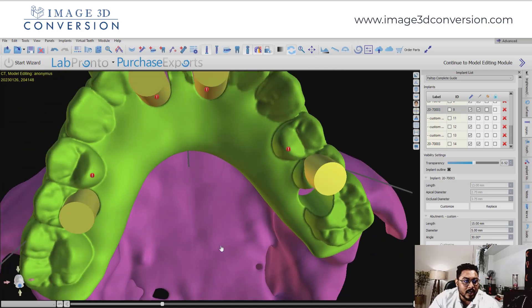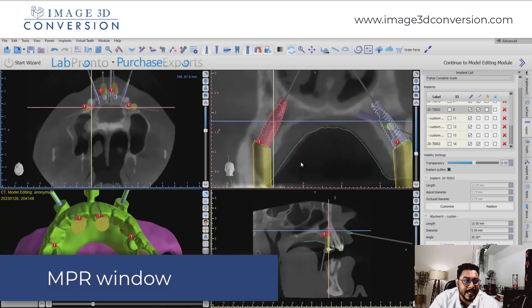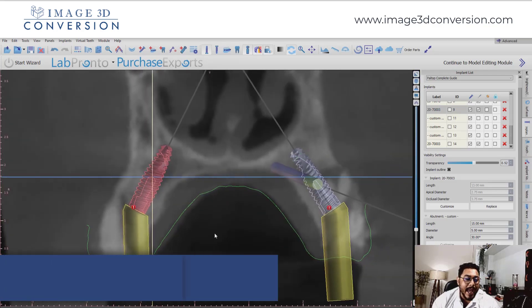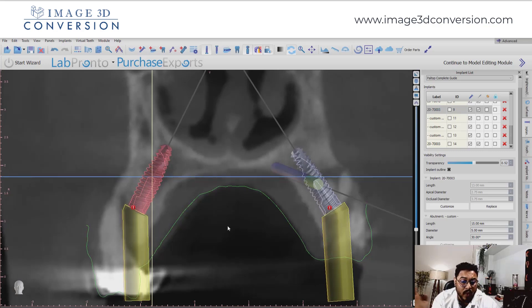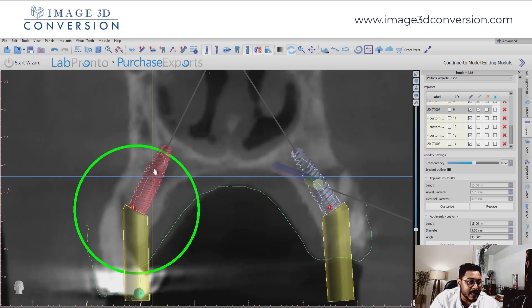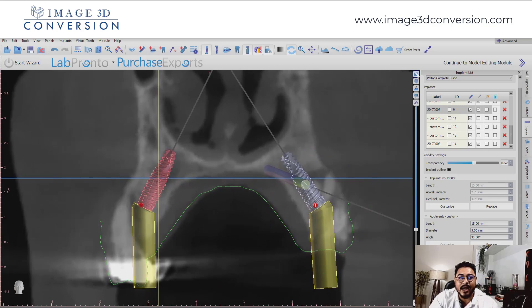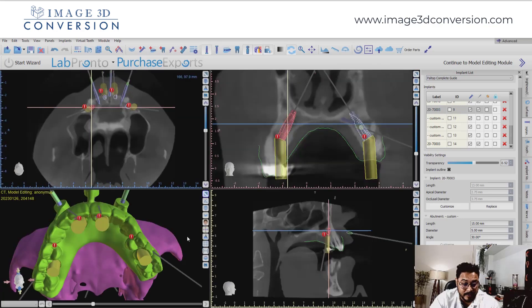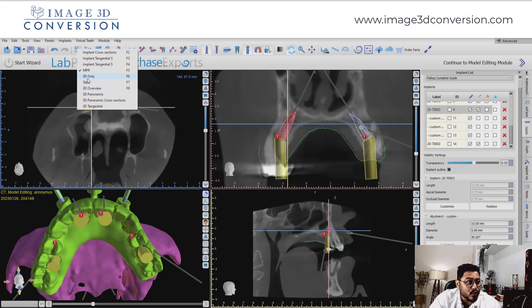One more window is the coronal window. In the coronal window, for full-arch cases, we position implants from one quadrant to another. For example, placing one implant in the first quadrant and then a second implant parallel to the opposite quadrant — simply duplicate the implant and shift it to the other quadrant. This gives us information on whether we are maintaining the AP spread recommended in all-on-four and all-on-six cases.